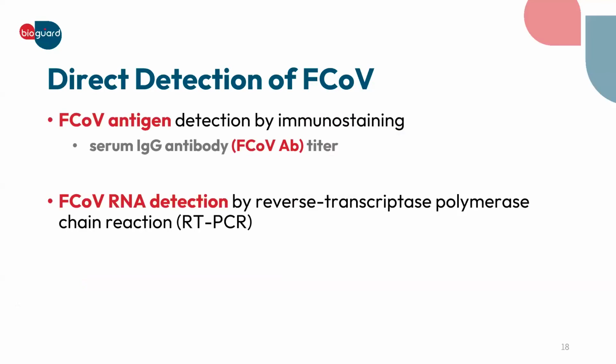However, if it's positive, you can further do some other tests that are available in the clinic, such as feline coronavirus antigen detection by immunostaining or through a rapid test, where serum IgG can be detected as well using FCoV antibody titers.